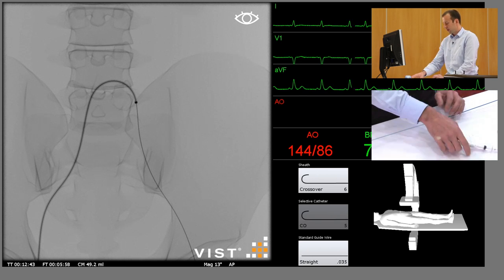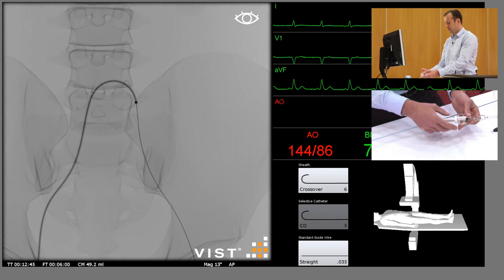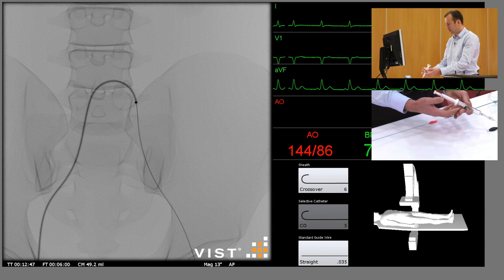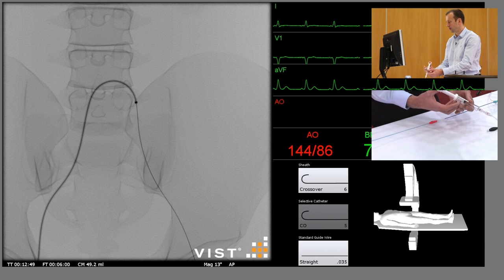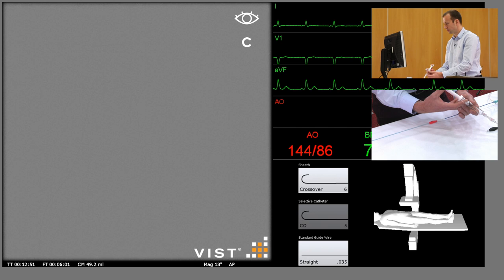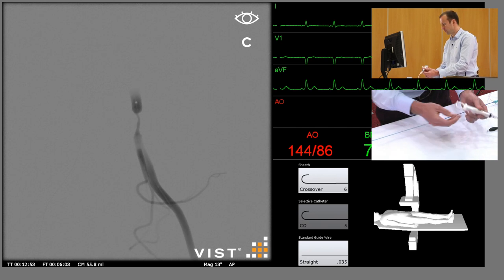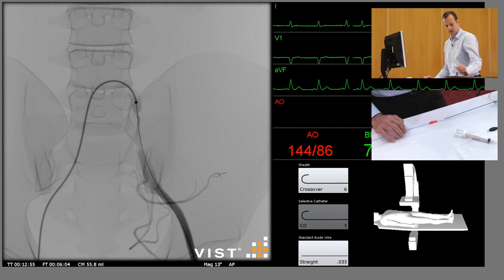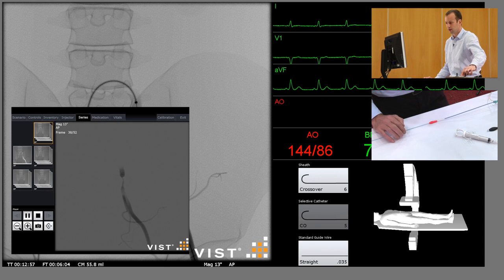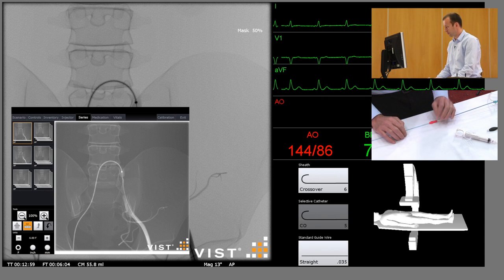At this stage we need to do another angiogram. The stiff wire will have distorted the anatomy, so another subtracted angiogram through the sheath, and again another reference image.